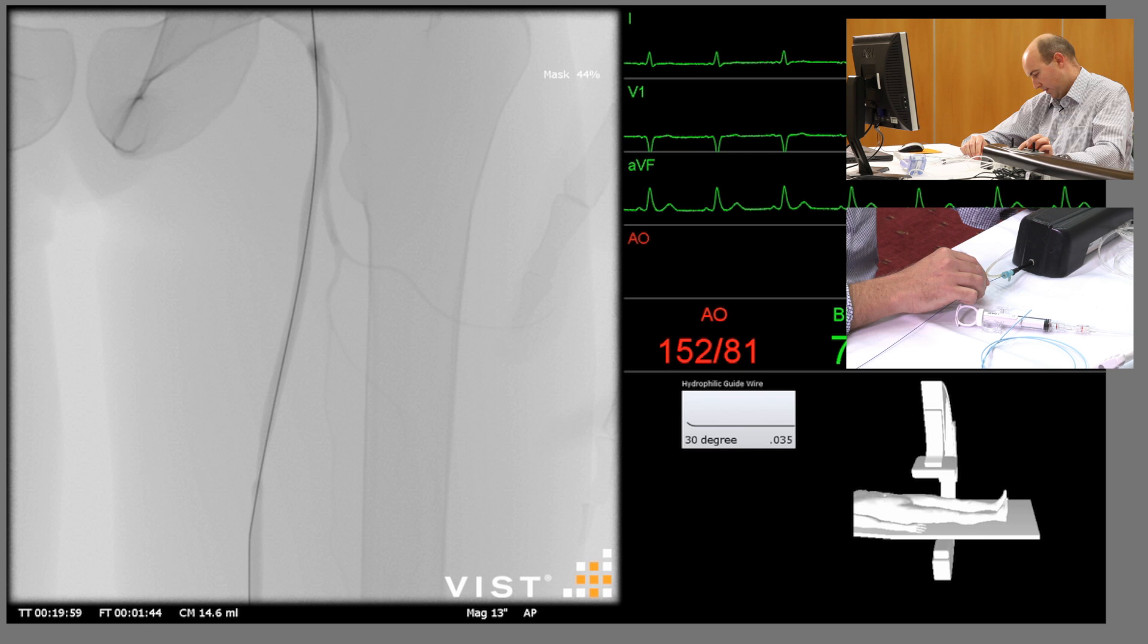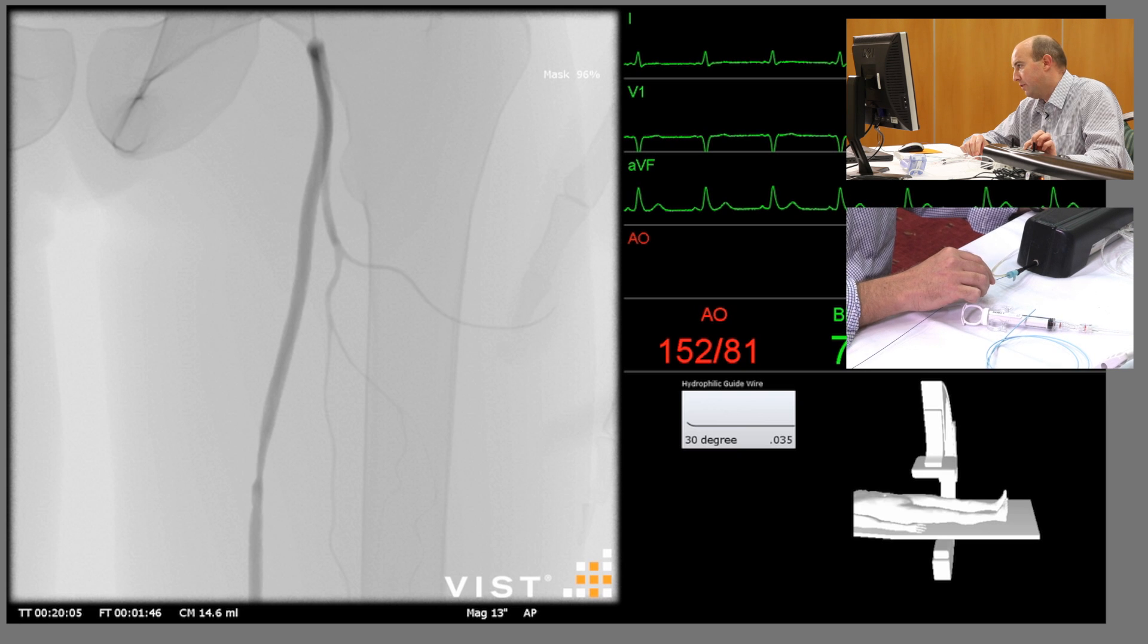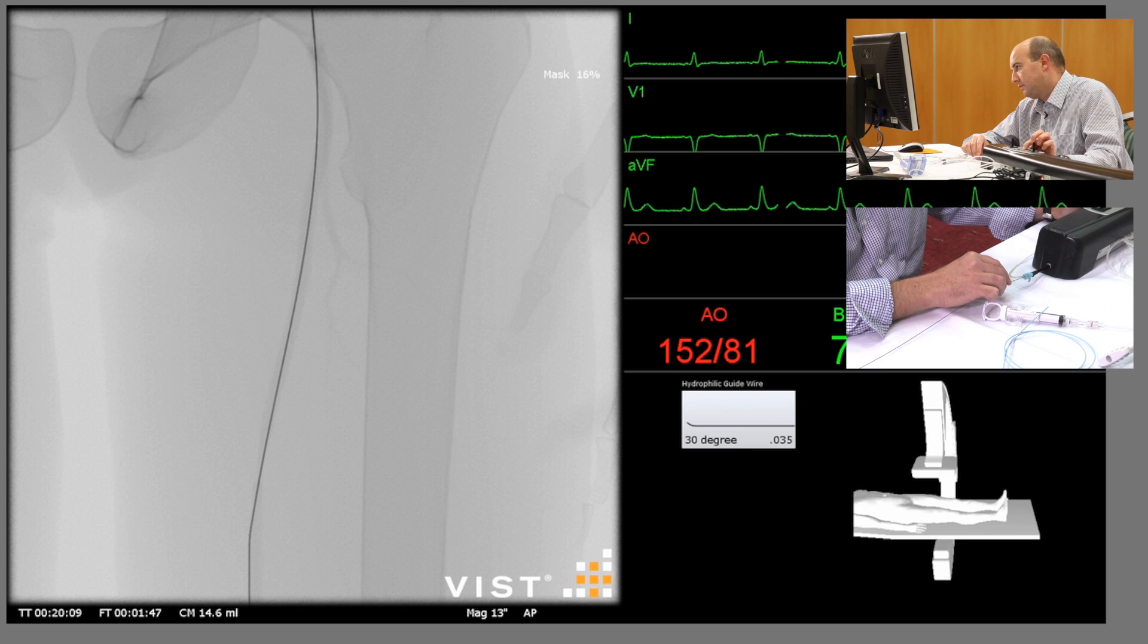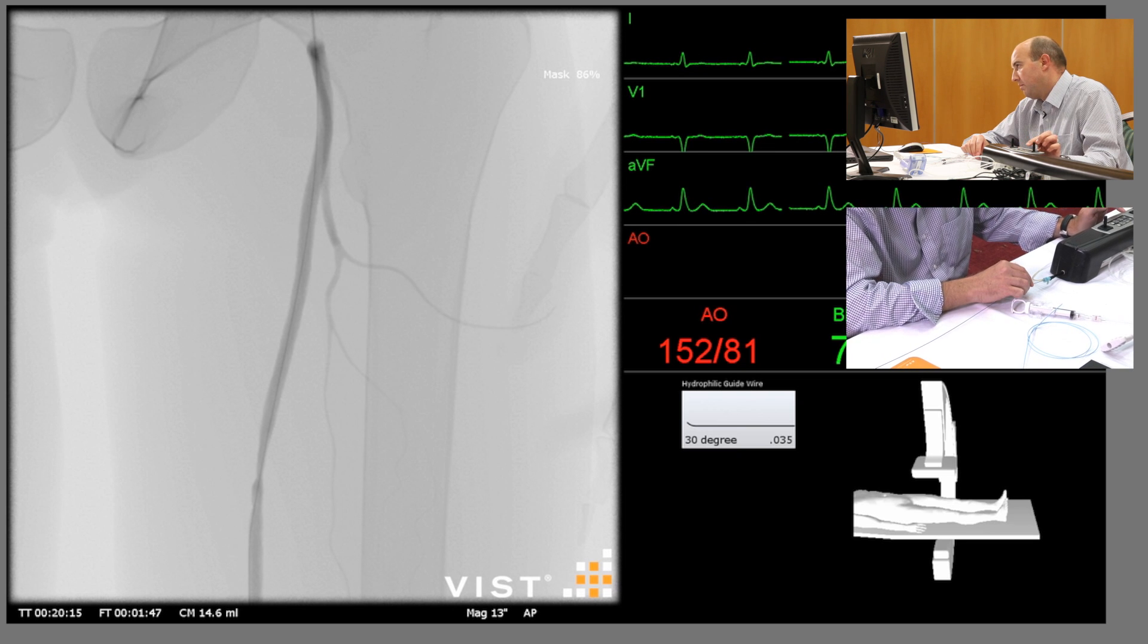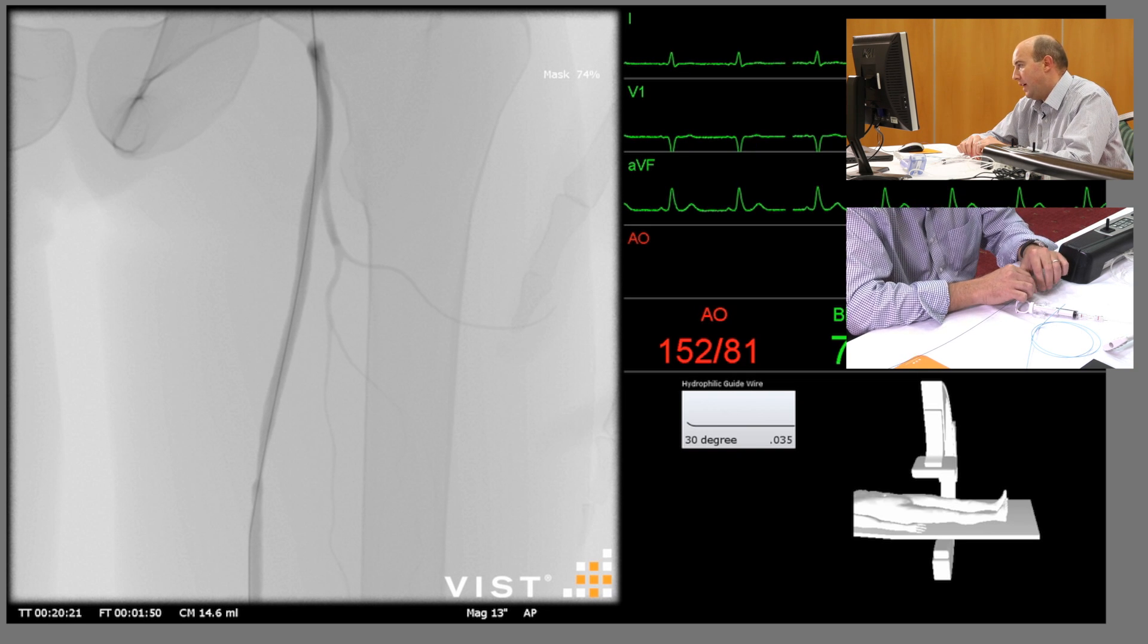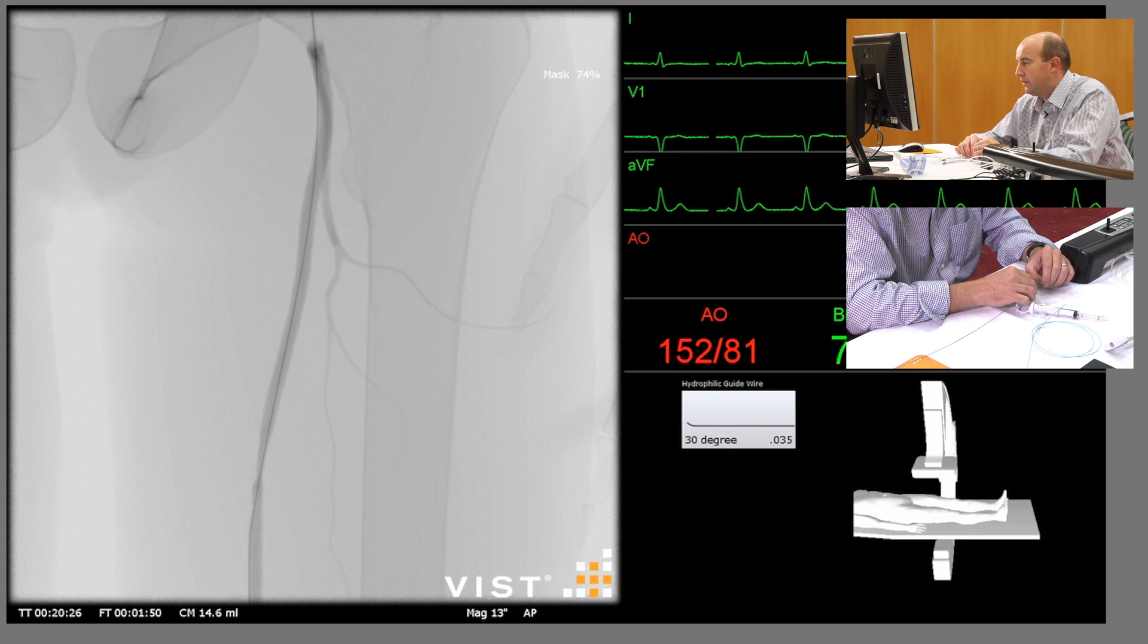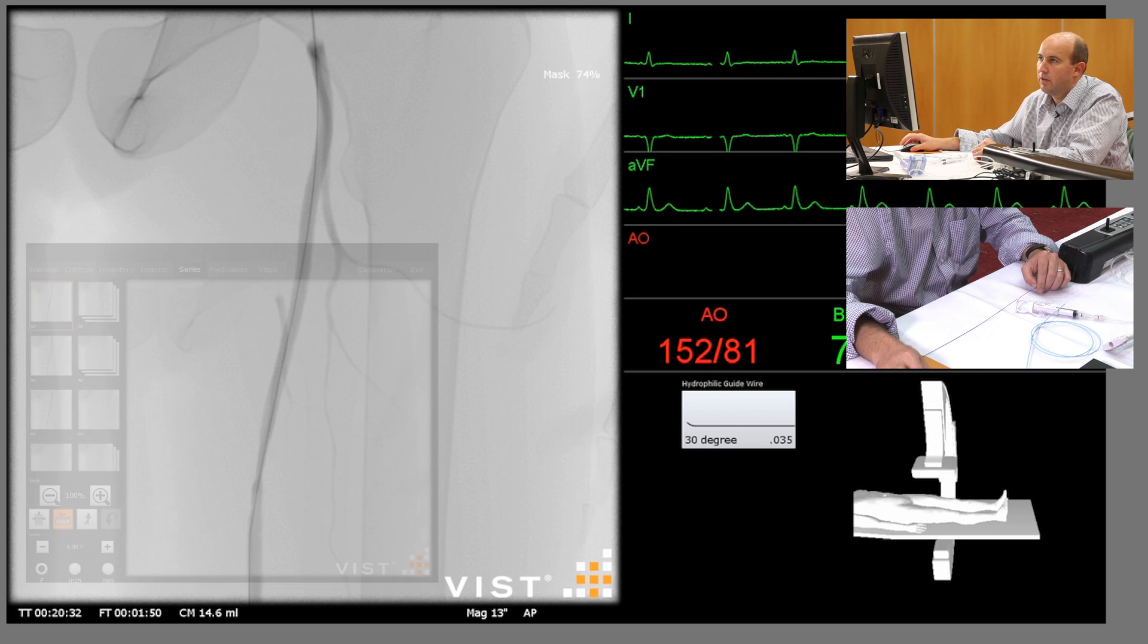The wire's in a good position now. We'll just double check where we are with the mask, and if you go to a full mask you won't see your wire. You can see the treatment area that we're going to want to treat. So leave the wire in place. In reality at this point you would give some heparin, but assuming that is done, go back to the control panel.